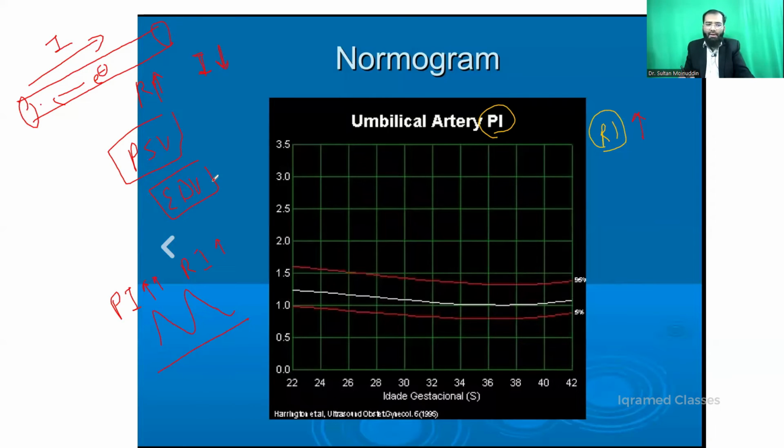Can you identify what waveform is this? This is the monophasic waveform. Okay, this is the monophasic waveform. Yeah, this is the monophasic. Now look here again.